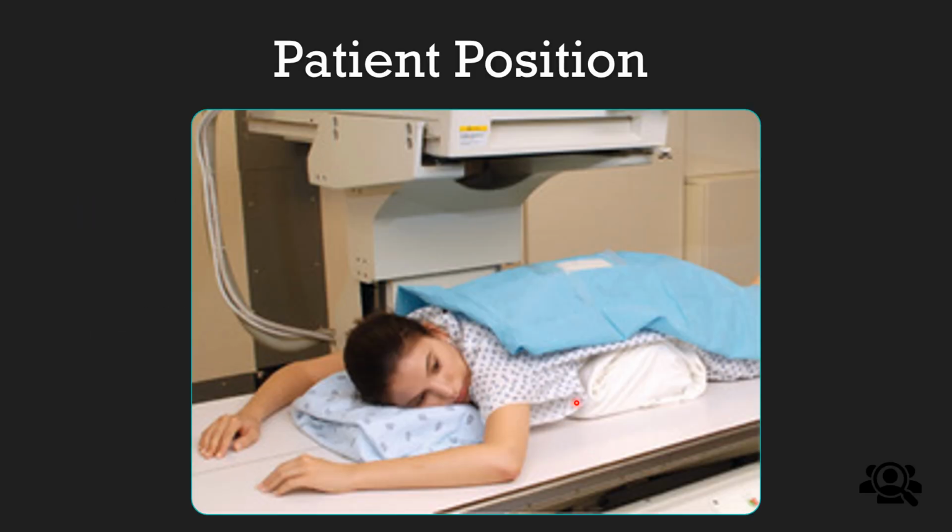Patient position: they're laying in the prone position. They'll usually put a pillow here, so this will kind of straighten out the back. If the back is completely flat, the needle will go in just like so.